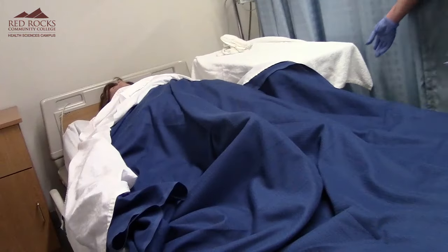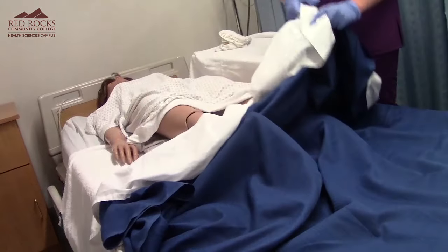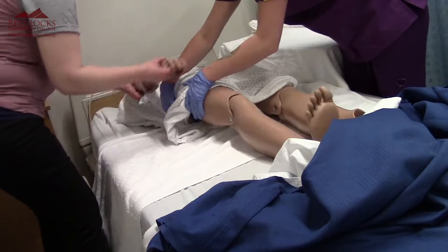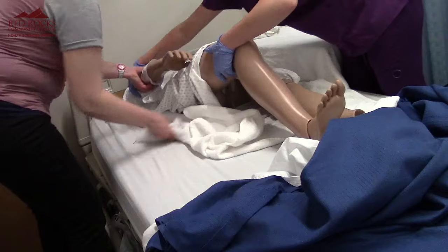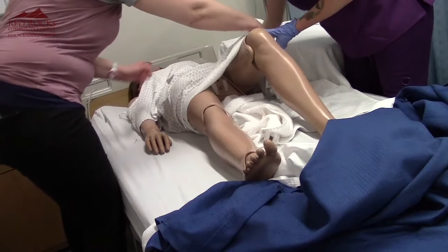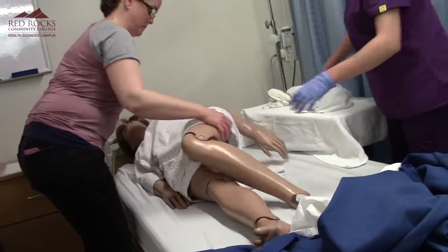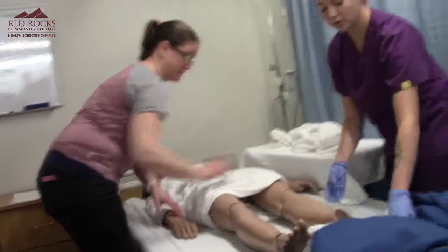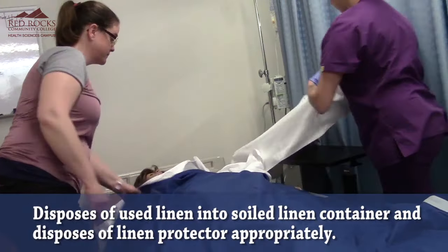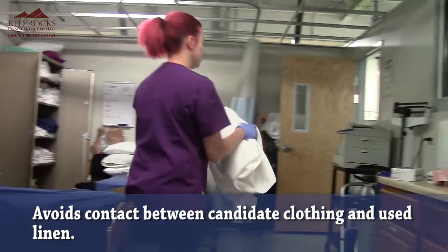I'm going to remove the barrier, and then my proctor will help me turn her. I'm going to lay it back down and cover her back up. I'm going to take all my linens, pull them together away from myself, and put them in dirty linens.